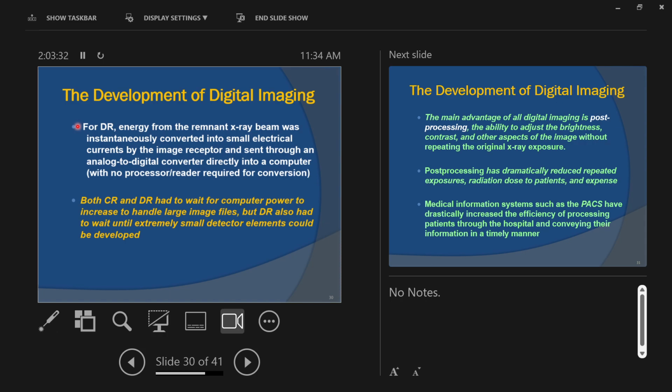So you have like an X-ray tech over here, standing behind a barrier, right? The scattered rays are going to hit that barrier and be stopped, yeah? Good. But we have an object, interacts with the X-ray beam. Some of those X-rays are going to come straight down and strike the image receptor. Those are the ones that are going to give us information about the body, okay?